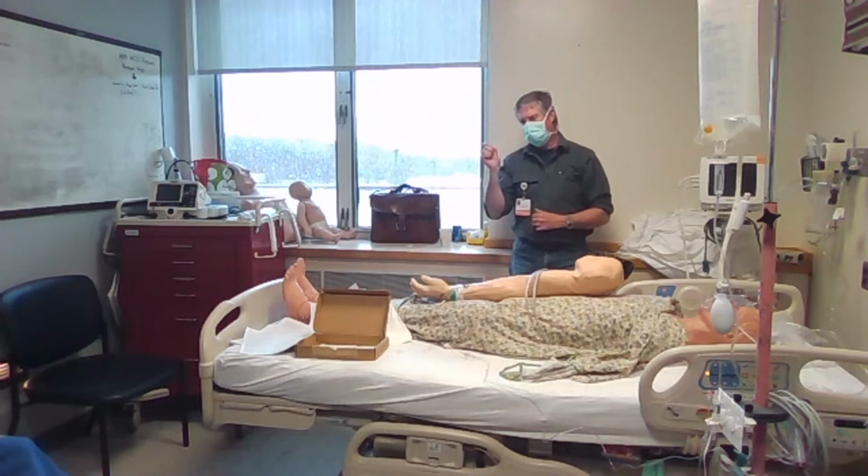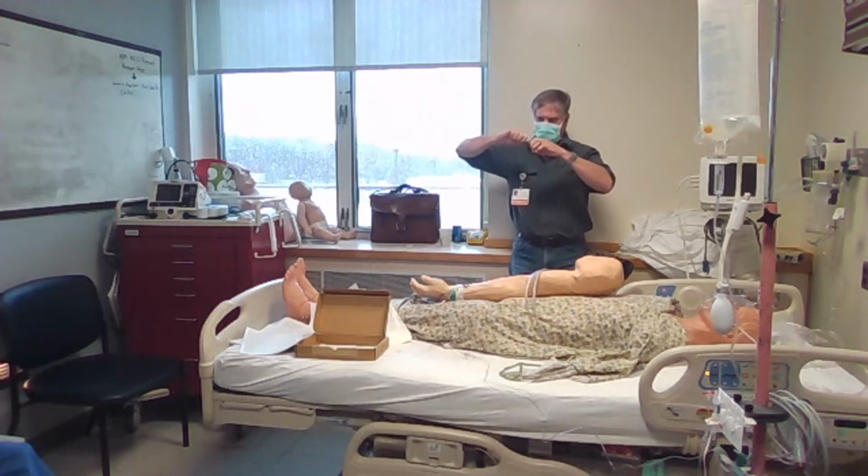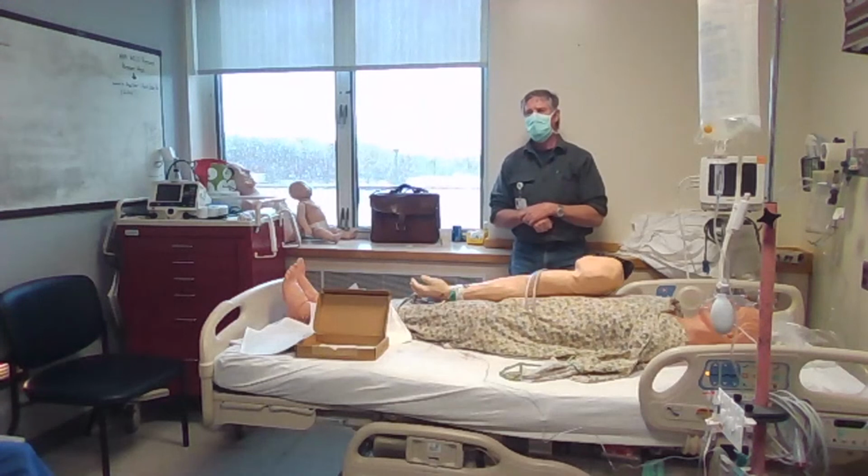You could, but without using the Seldinger technique, it's really hard to thread a catheter into the artery, because the artery has a muscular wall as opposed to the vein. The vein is really easy to slide through because it has a paper thin wall. The artery is a thick muscular wall and it's hard to get that catheter through without tearing it. That's why this makes it so much easier. You'll never get it otherwise.